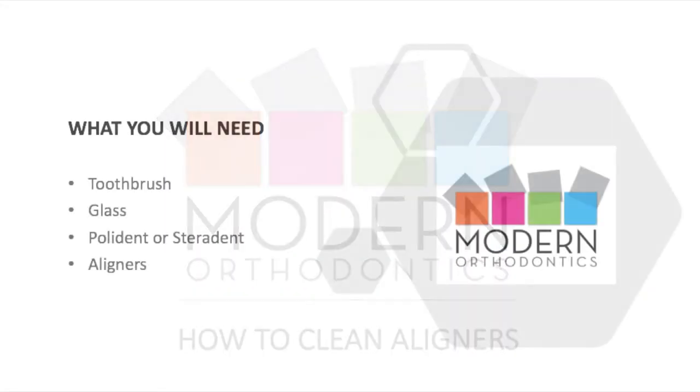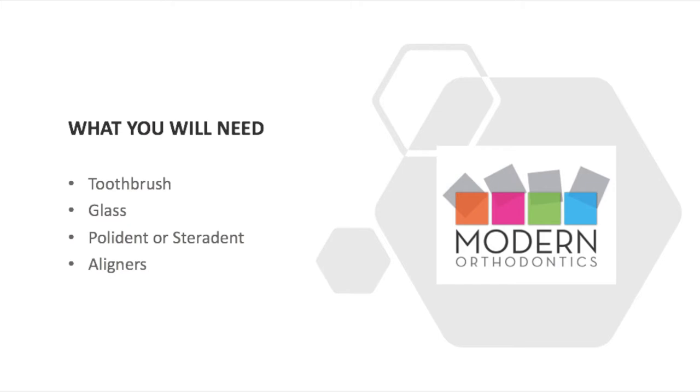How to clean your aligners. What you'll need is a toothbrush, glass, Polident or Steradent, and your aligners.